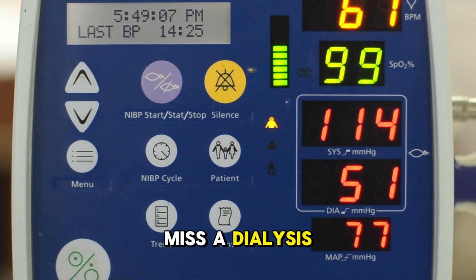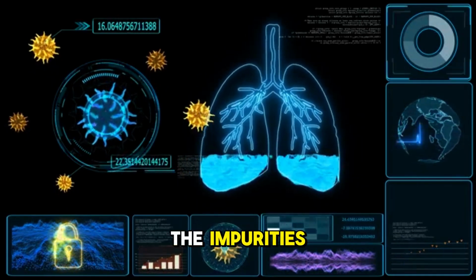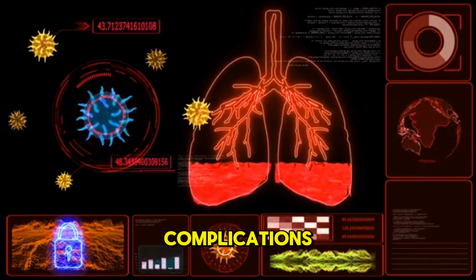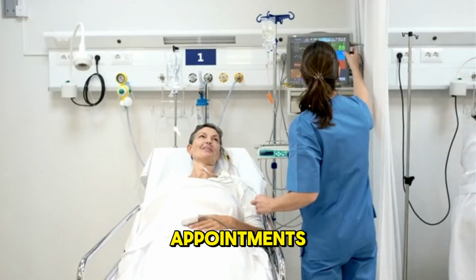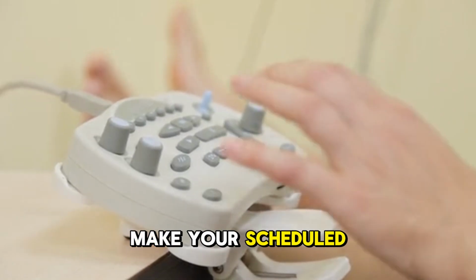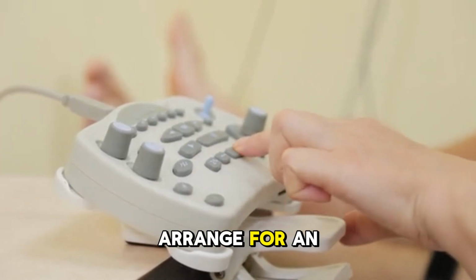What if I miss a dialysis treatment? If you miss a dialysis treatment, the impurities that have built up in your body may cause serious complications. You may feel sick, and you may need emergency dialysis. It's important to keep your appointments unless your doctor tells you otherwise. If you cannot make your scheduled appointment, contact your dialysis center as soon as possible to arrange for an alternative time.